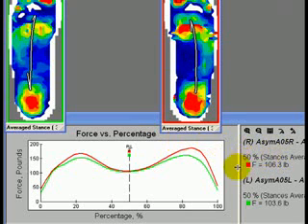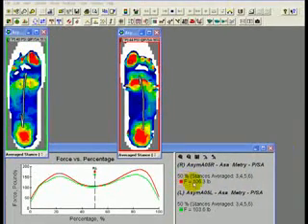And also, if you look at these force numbers at the same point in time, they're 106 under the right foot versus 103 under the left. So these forces are a lot closer.